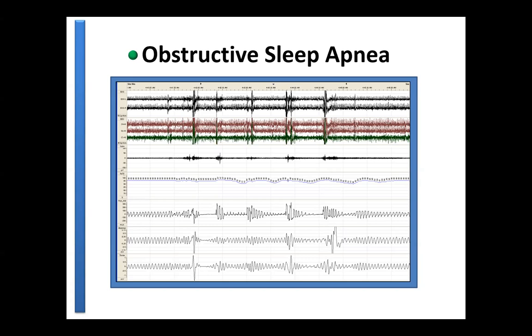Well, before, yes. So at the beginning, it seems that the activity is pretty similar to the ending. I mean, the same frequency pretty much and the same synchrony as well. Okay. And same thing. I think the only difference is probably the oxygenation seems to be kind of recovering at the end, where it was pretty stable at the beginning. Okay. And the submental chin activity is the same as well. And for the most part, I think the EEG is similar. Okay. So I'm going to tell you that there was no change in position. There was no change in state. There was no change in anything that people could perceive you looking at the camera.